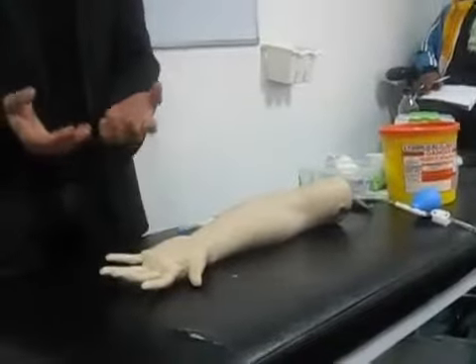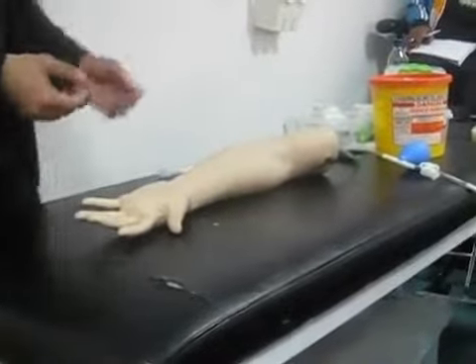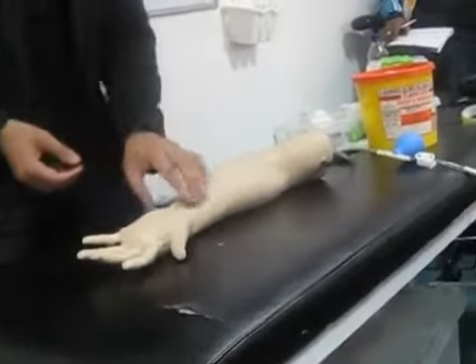Can I please have a pair of plain gloves? I mean, simple gloves. Assume you are. Right, thank you.